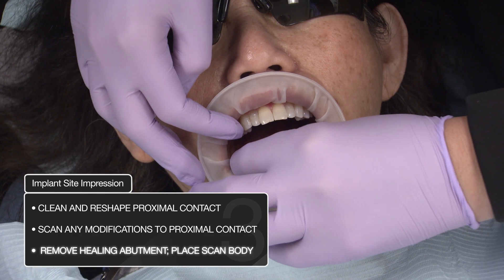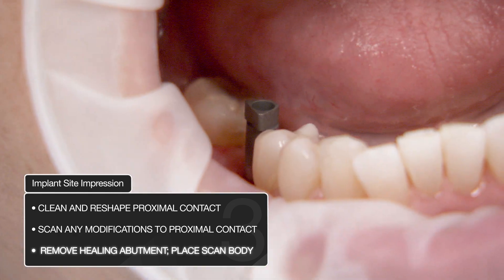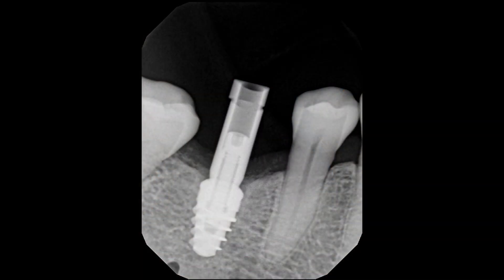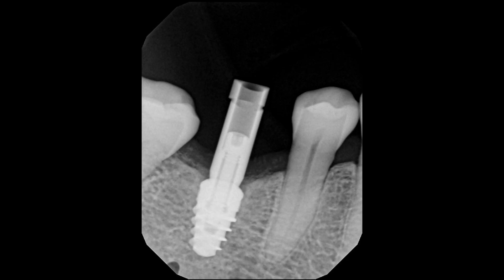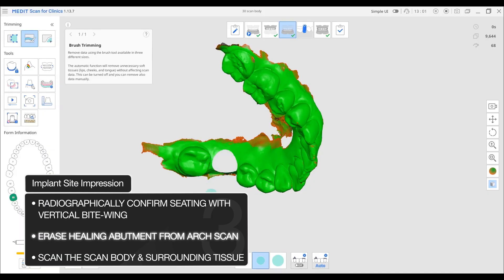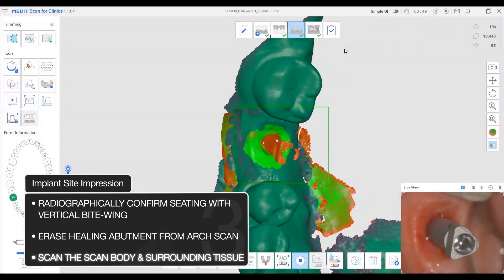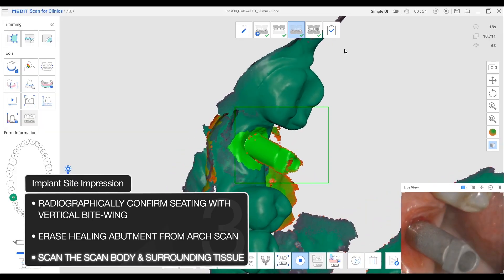Once the updated contact scan data is acquired, the healing abutment can be removed and the scan body seated and hand tightened. A vertical bite wing should be taken to ensure the scan body is fully seated. Visually confirm that the interface is fully seated with no gaps at the platform. The healing abutment is then erased from the arch scan and the scan body is captured from multiple angles to ensure that the scan captures all indexing surfaces and geometry.